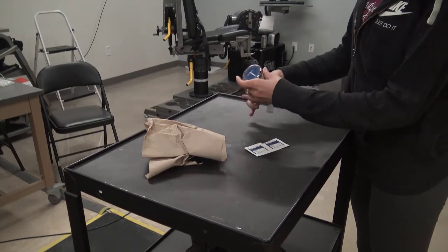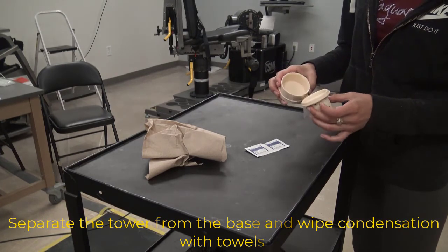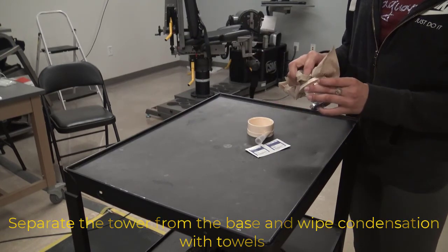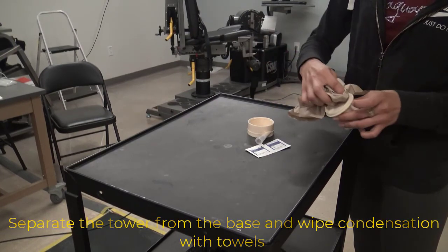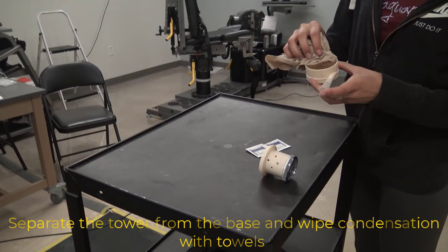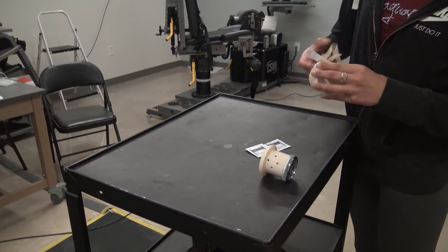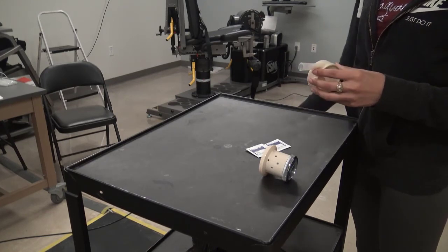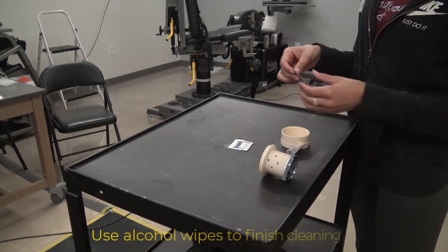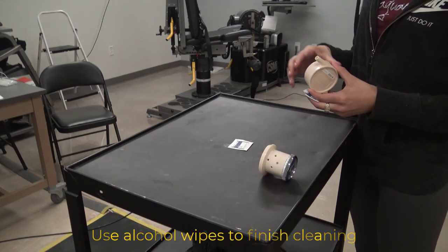Then finally, we're ready to clean it. So we can remove the tower from the base. This should not be screwed on too tightly, so it should be easy to come off. Then we just wipe any condensation with a paper towel. We get all that excess moisture out of there. Typically it's around the holes on the top of the tower and at the floor of the base there. Once we're finished, we'll discard that and take some 70% isopropyl alcohol wipes and do the same to disinfect it. We can remove the mouthpiece and discard that.